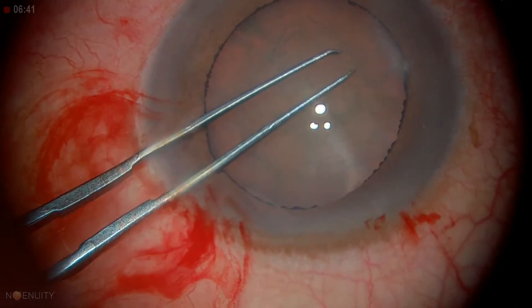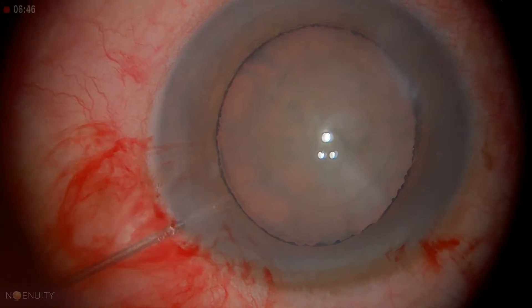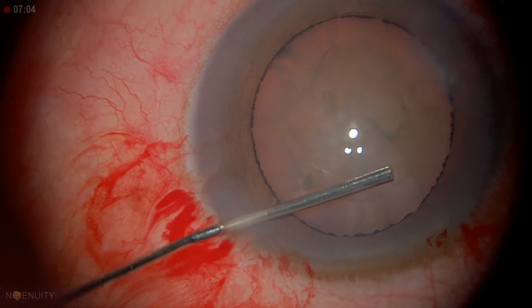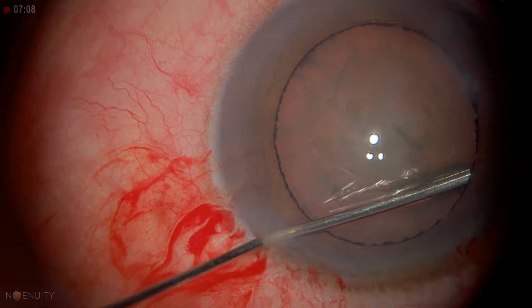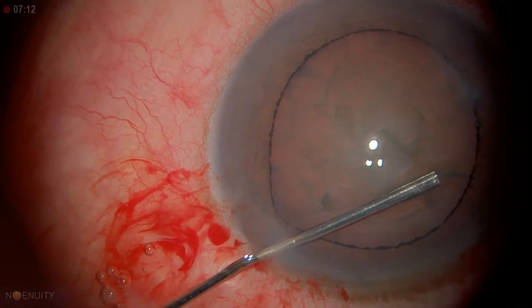When we do the hydrodissection, our goal is to not go 180 degrees across, but about 90 degrees away where we can see the edge of the capsule very well. Going under the edge here, I'm lifting up and pushing. I already see the fluid — the lens is rising — so I'm going to stop.